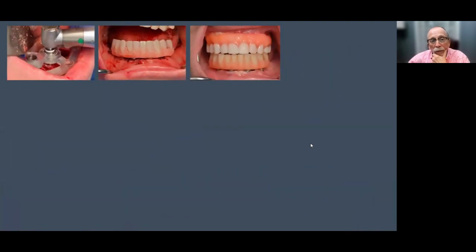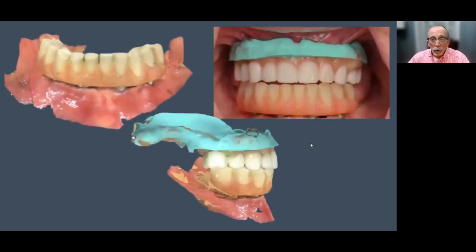And the steps are, again, see, this is one of Dr. Ludlow's cases, right? Obviously, the left picture is placement. That was from a plan, surgical guide. And then there's the healing, the prototype, upper denture. This patient was going to get an upper new digital denture and a lower bridge base case. So here we are after healing. Dr. Ludlow did a wash impression.